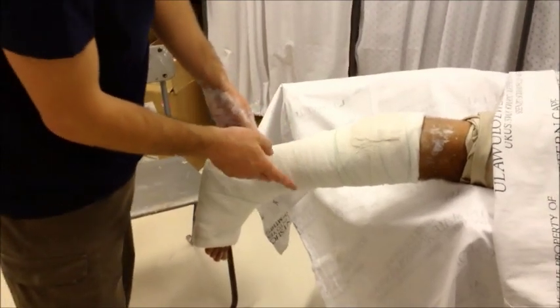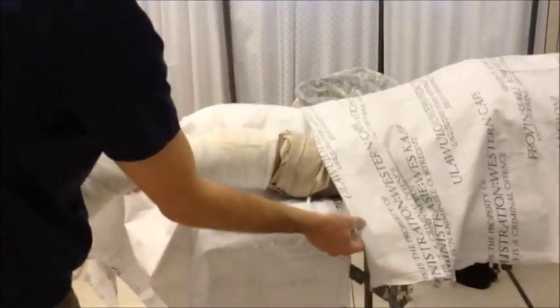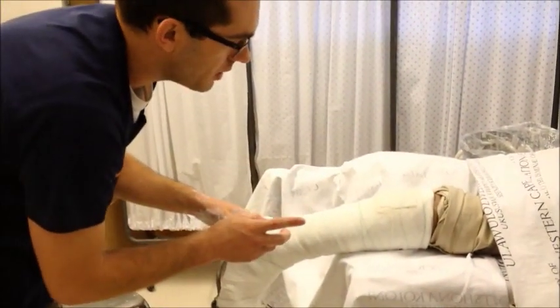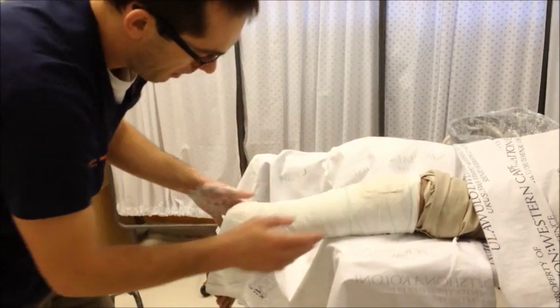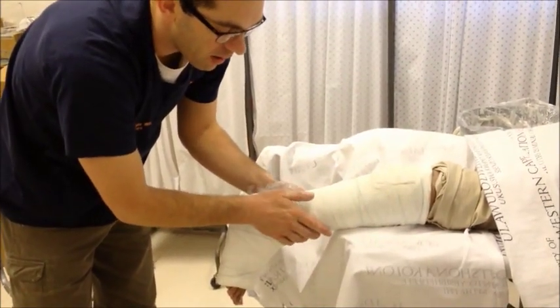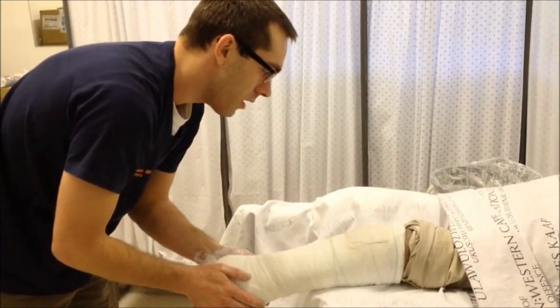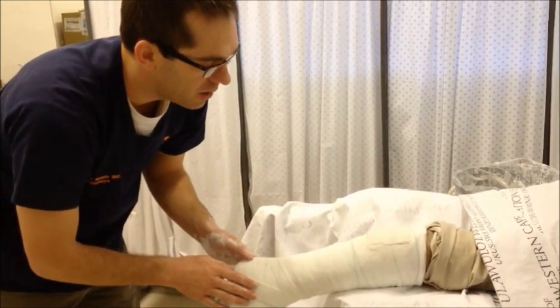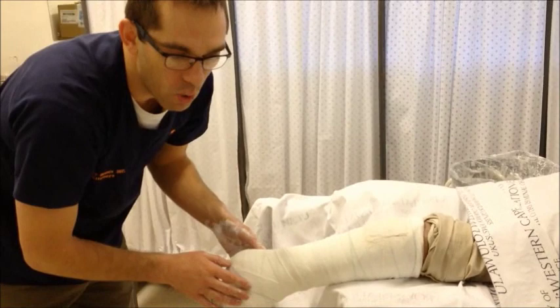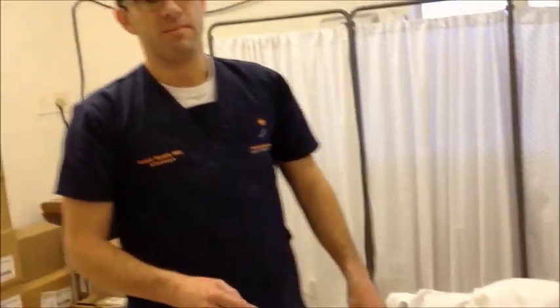Wait for it to dry. At this point it's a good idea to ask the patient to move up on the bed a little bit — it's more comfortable for them, but don't let them get off the bed or put their foot down yet because they're likely to crack the plaster. Critical points: comfortable position for you and your patient, make sure critical pressure points and danger points are flared and taken away, think intelligently about how far around you want the slab to go. Make sure everything is nice and neat — take pride in your work. This patient, depending on the injury, would follow up in two to five days for a vascular check or a change into a circular cast. A good quality below knee back slab will get you out of trouble every time.